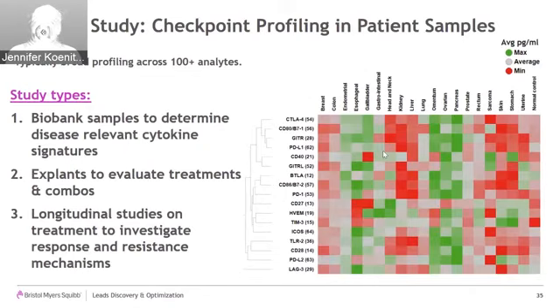And another focus for us is also performing longitudinal studies on treatment, particularly with anti-PD-1, to investigate the response to treatment or the development of resistance mechanism and their impact on the respective biomarker signatures. Further, what we also frequently do is use explants to evaluate individual treatments and treatment combos. And this biomarker data, the multiplex Luminex data, is typically one key readout of those types of studies.